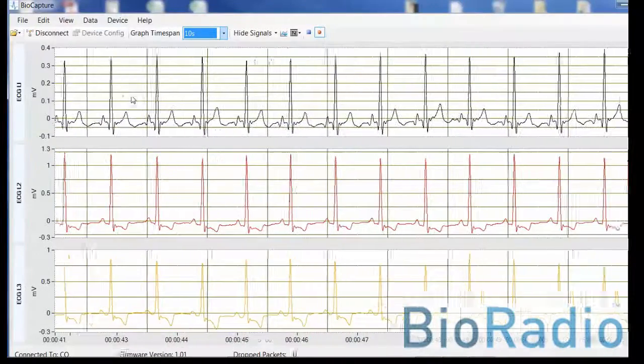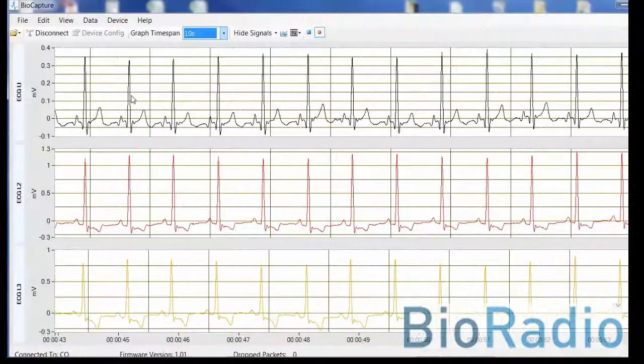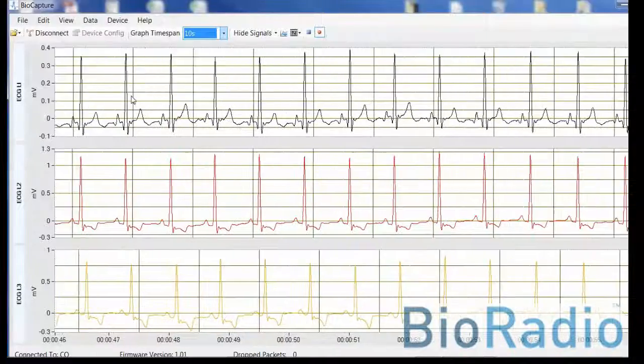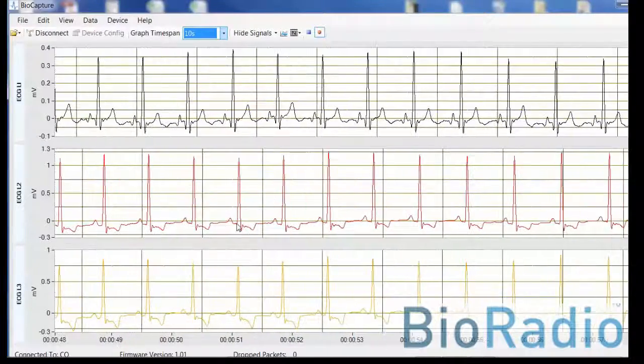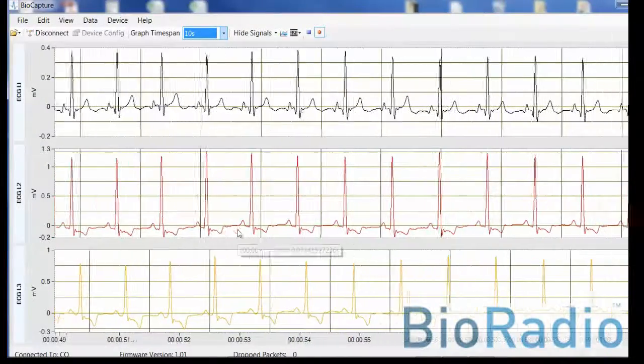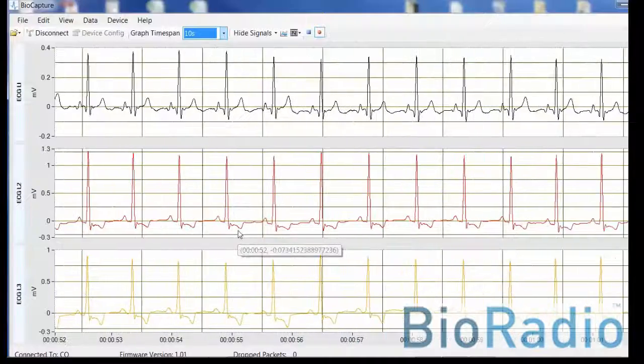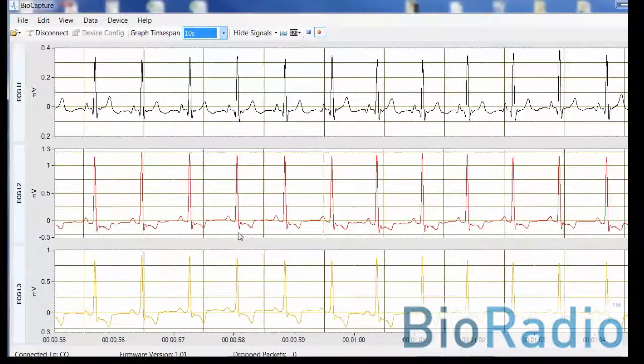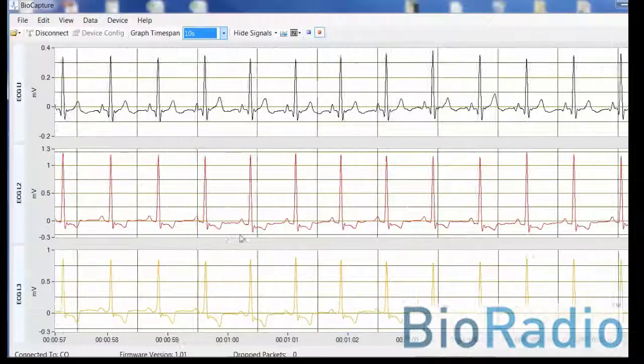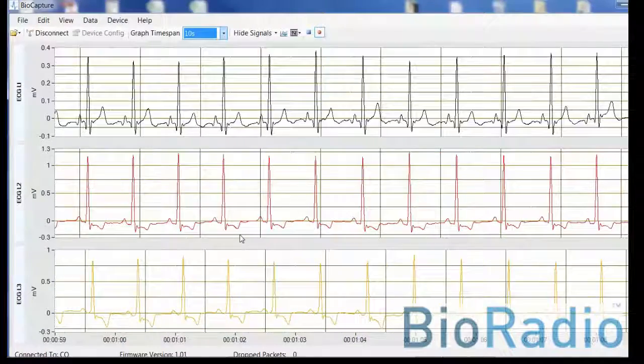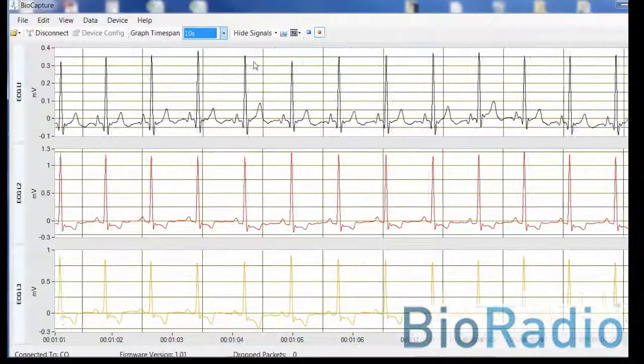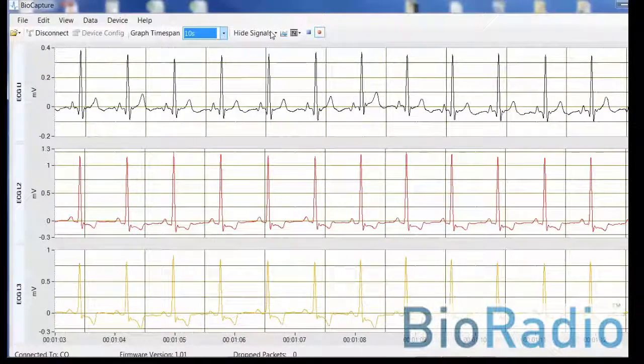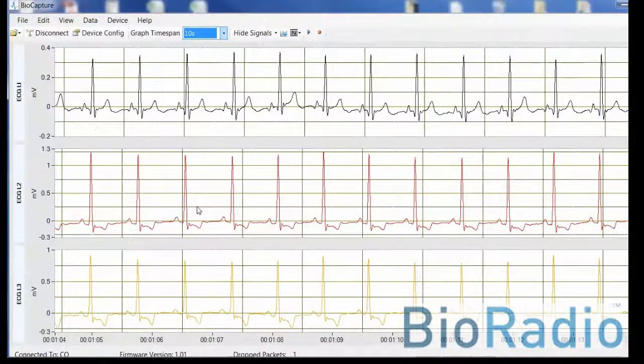As you see here, you can view the QRS signals. As you're acquiring the signals, you can program different sampling rates. Once you've gathered your data, hit the stop button.